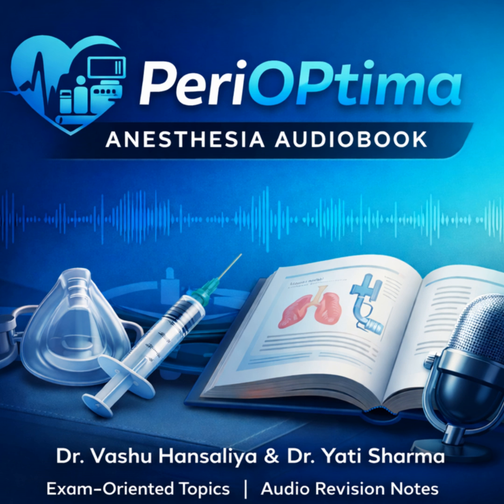Overdamping, like if there's a clot, a kink, or an air bubble in the tubing, makes the waveform look all smoothed out. It underestimates your systolic and overestimates your diastolic. The MAP usually stays accurate, though. Correct. And underdamping or ringing makes the waveform look spiky. That happens with excessive tubing length or stopcocks. It drastically overestimates systolic pressure. You check this with the fast flush test or the square wave test.